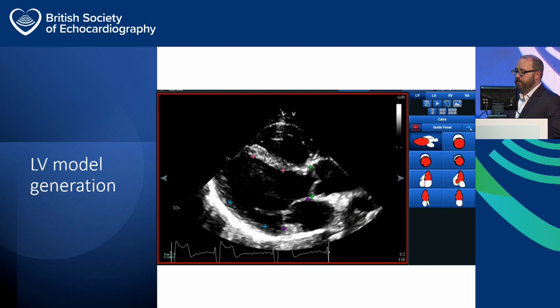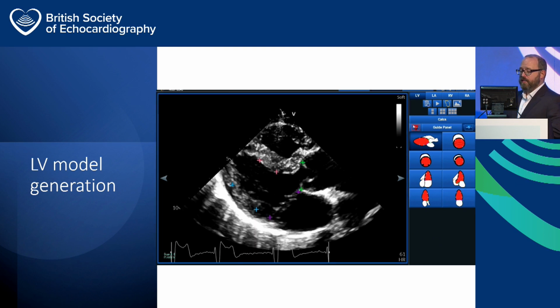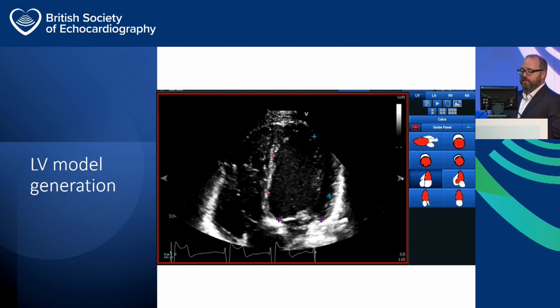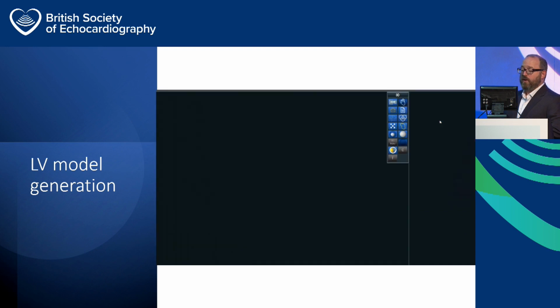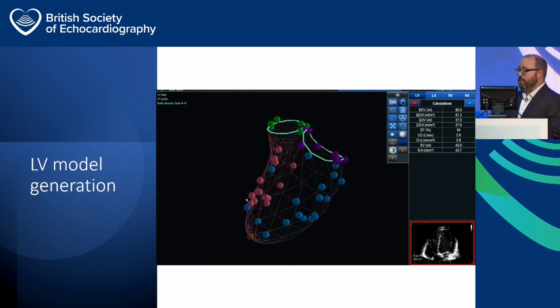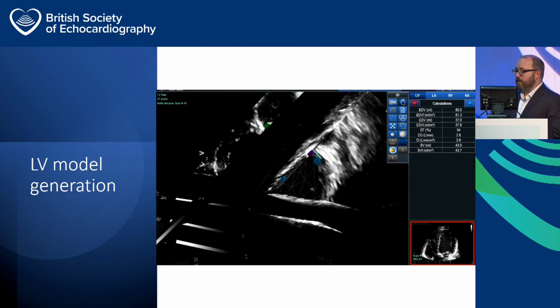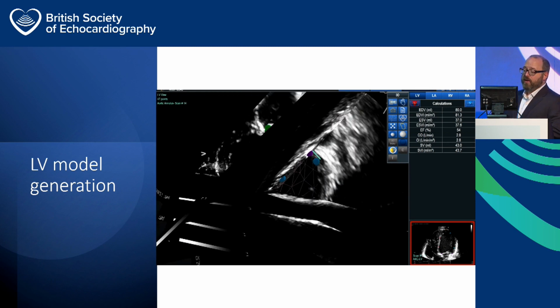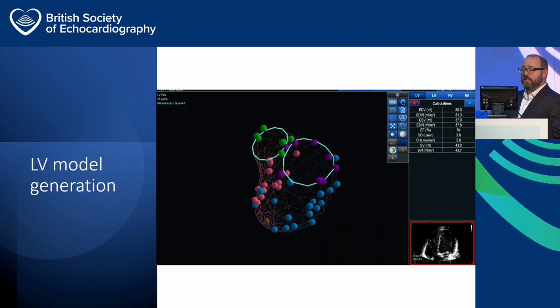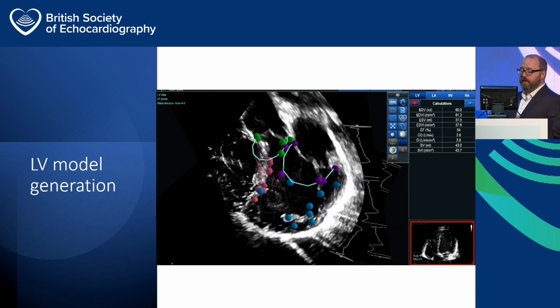You can also, of course, do the same thing on the left ventricle. Again, it's a very similar process. We take multiple acquisitions. We mark off the points in the ventricle. We use the reconstruction algorithm, which is tuned to the left ventricle. And again, this is really useful as well because you could have a patient in whom it's very difficult to do a biplane Simpson on the apical views. You may see the mitral valve annulus on the apical views. However, your endocardial borders may be better seen on your parasternal short axis views. And you get to combine the two because we've registered the information in 3D space.